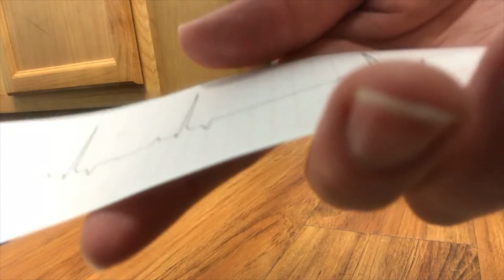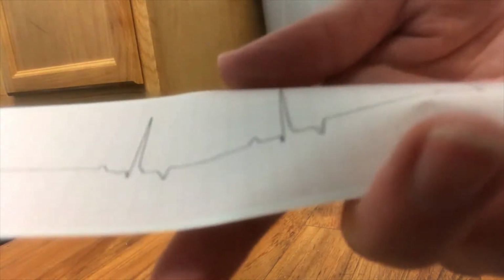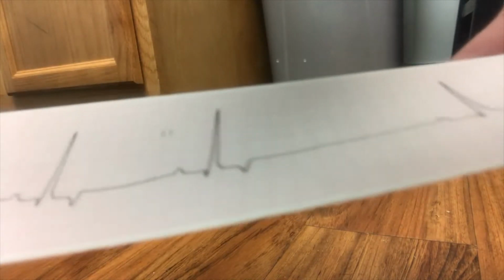There's P waves with every QRS. Everything looks pretty regular. Like I said, there are a few little bits of irregularity that could indicate the sinus arrhythmia. So all in all, except for that one VPC, looks like she had a pretty good EKG.